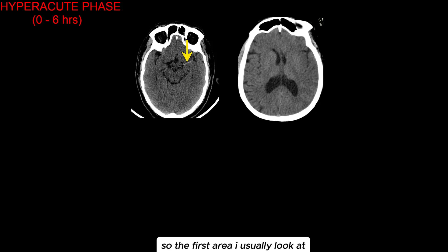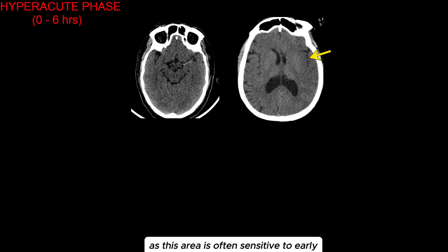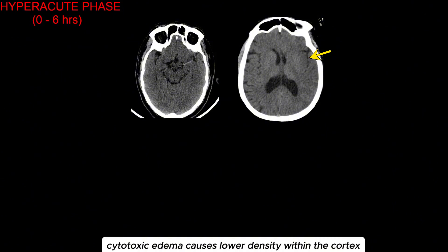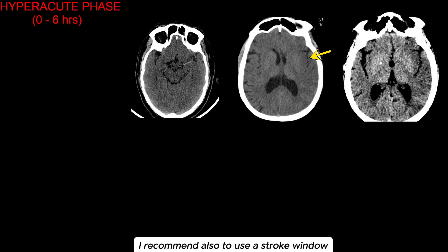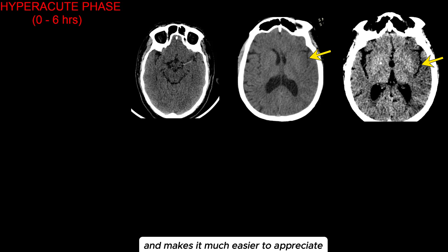The first area I usually look at is the sylvian fissure, as this area is often sensitive to early ischemic changes in MCA infarct. Cytotoxic edema causes lower density within the cortex, so the differentiation between the cortex and underlying white matter is no longer apparent. I recommend also using a stroke window, which may exaggerate this difference and makes it much easier to appreciate these ischemic changes.